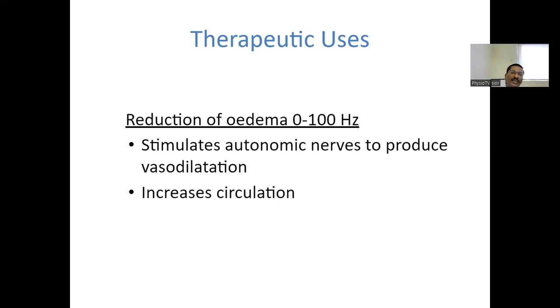So the next therapeutic effect is the reduction of edema. For this, we can use a range of frequency of 0 to 100 hertz, which stimulates the autonomic nervous system to produce vasodilation and increase circulation.